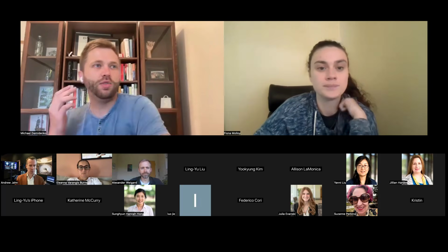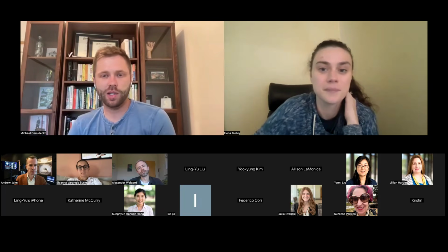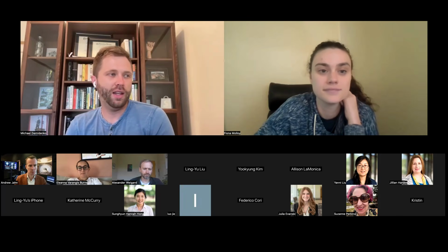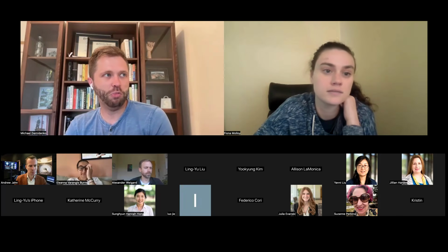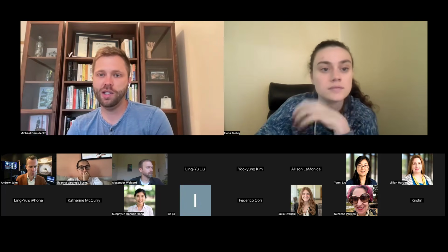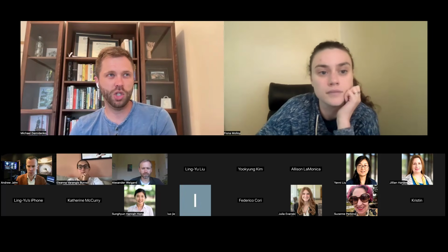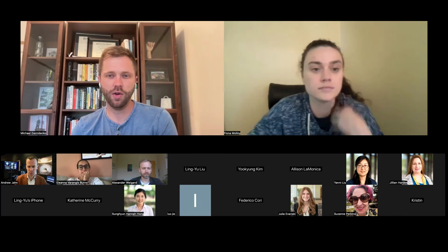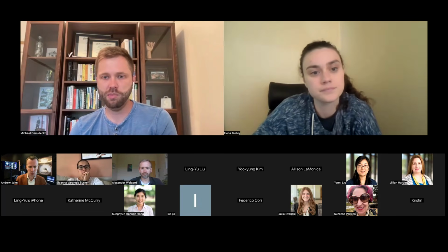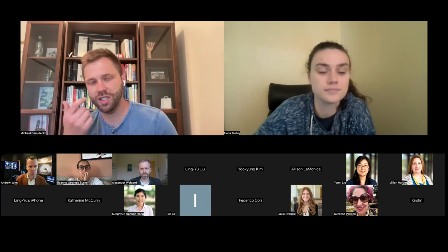Yeah, so I'm trying to motivate Chris to include cluster corrections and use them, because right now they don't give that as an option, but that's a simple modification of the workflow, and I think it's an essential one. And while Nilearn's and other algorithms' cluster correction algorithms are slow, it should be an option because that's how people report. So why can't we just threshold stuff.